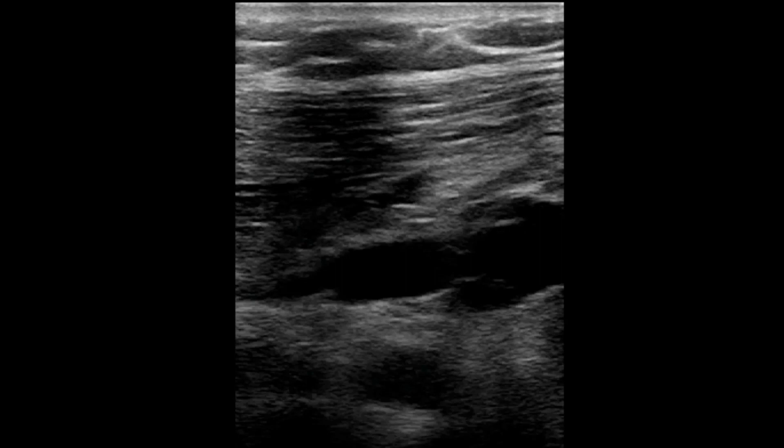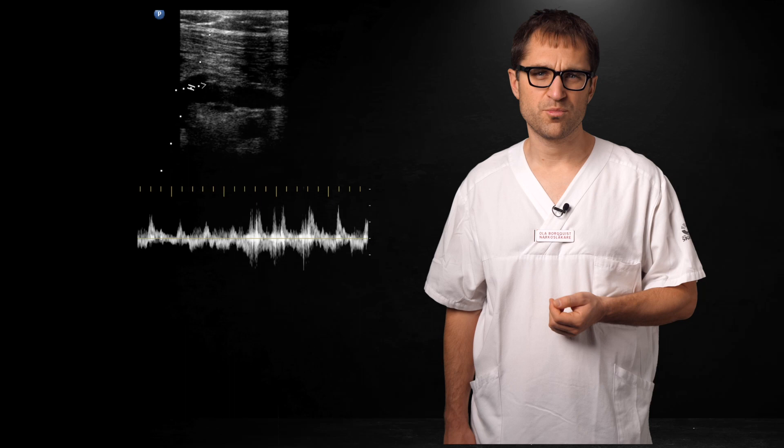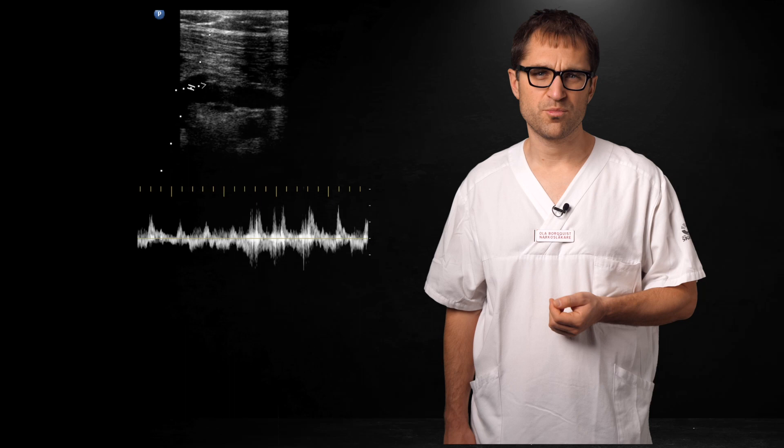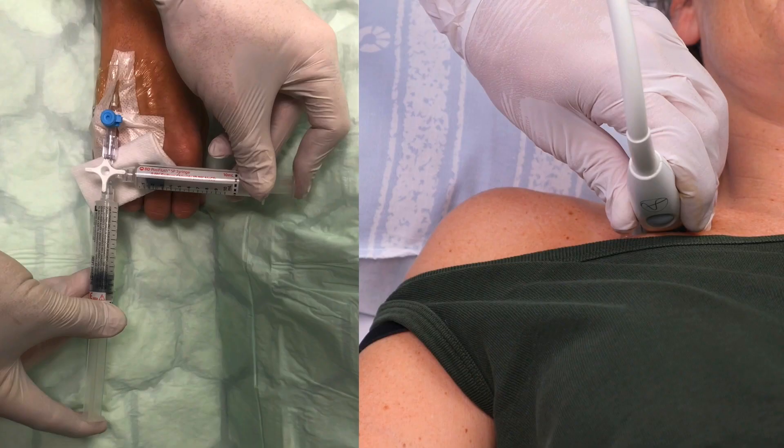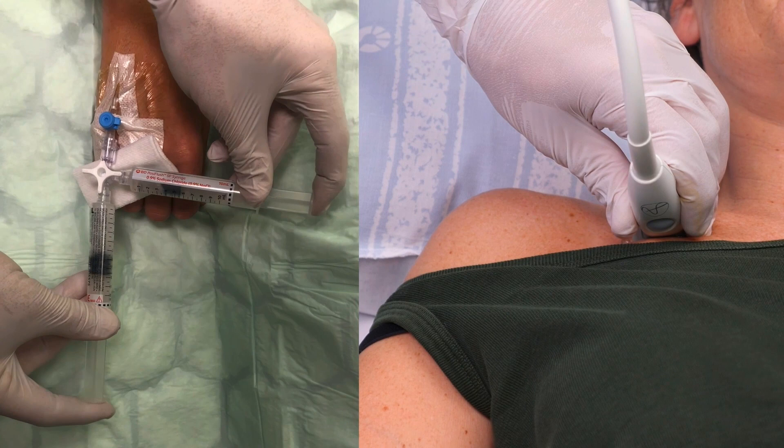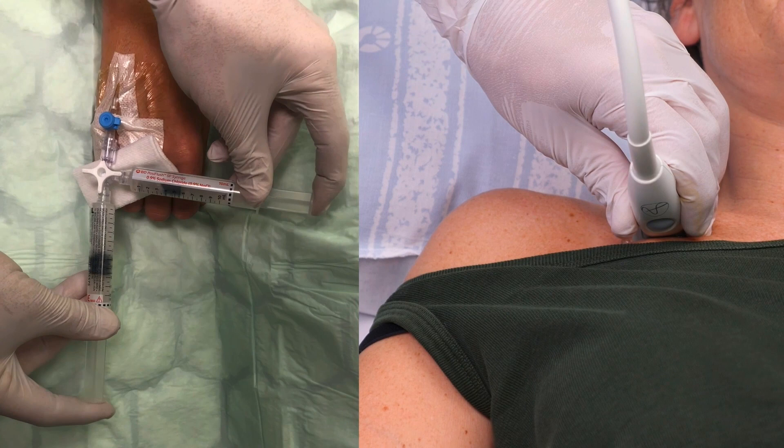Here's an example where this was useful. The location, the valves and the general appearance would suggest the more shallow vessel is a vein, but the pulsatility made me hesitate. However, the pulse wave Doppler showed a typical venous pattern, especially when compared to the signal from the other vessel which was definitely an artery. For extra credit, if the patient happens to have an ipsilateral peripheral cannula, you could use agitated saline to differentiate the vessels.